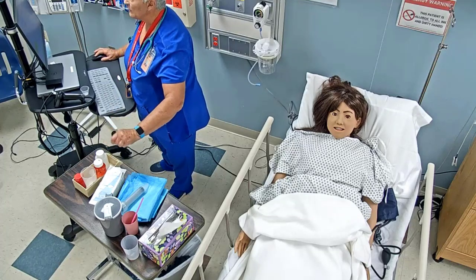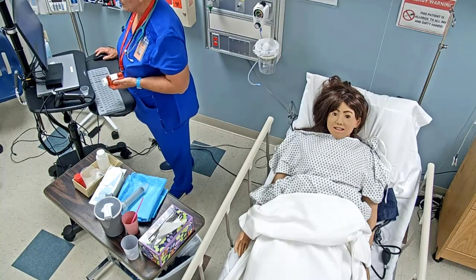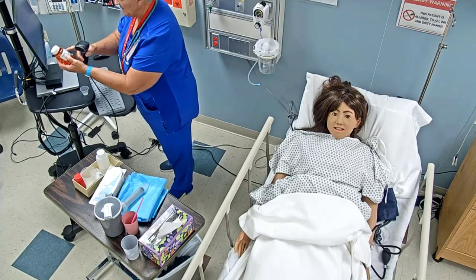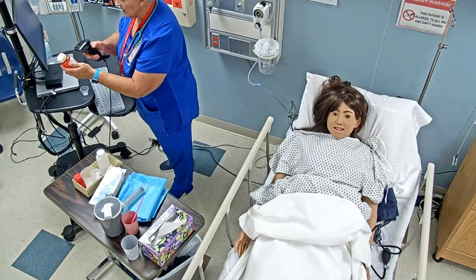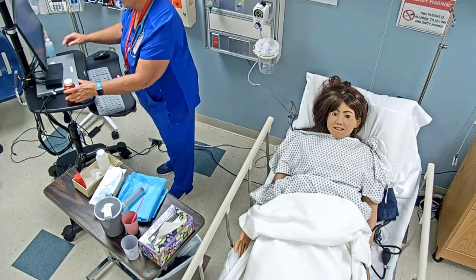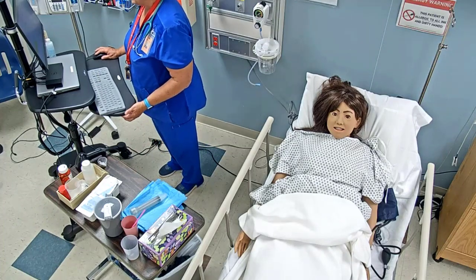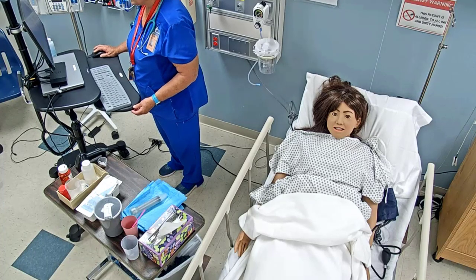And I have Anna Taylor, date of birth 4/24/1991. No known drug allergies. My next medication is Pepcid 20 milligrams oral suspension daily per PEG tube. This is going to be the 9 o'clock dose. Okay, and I've got Pepcid 20 milligrams per 15 mils. Expiration 1/1/2030, and it's intact. And so I'm giving 20, so I'm going to do 15 mils. Okay, so I've got my medication scanned. And so I'm going to go ahead and get my stuff ready to do that.